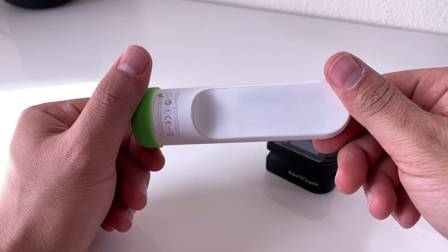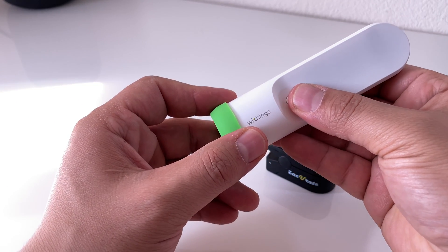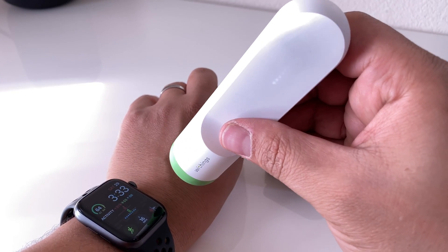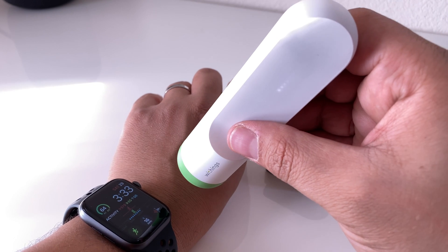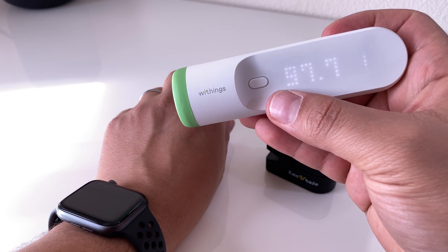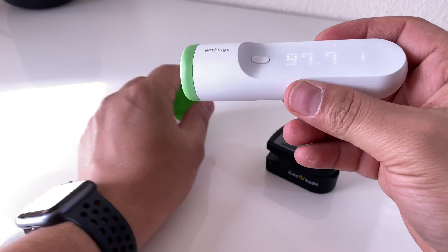They come in a lot of shapes. I like this one because it's a family thermometer, so multiple people can use it. You can use it on your skin, forehead, or any surface. It gives you a reading using infrared. Now that I have this temperature, I know I can send it to my phone and assign it to my account.